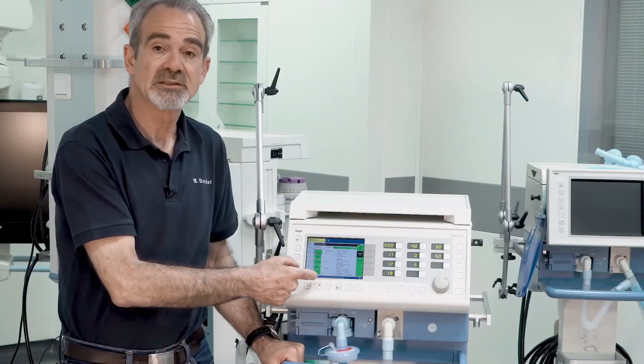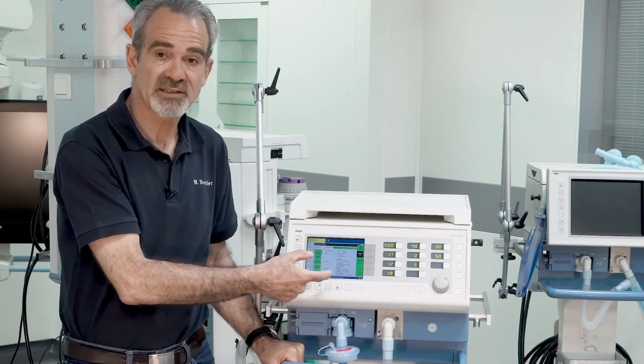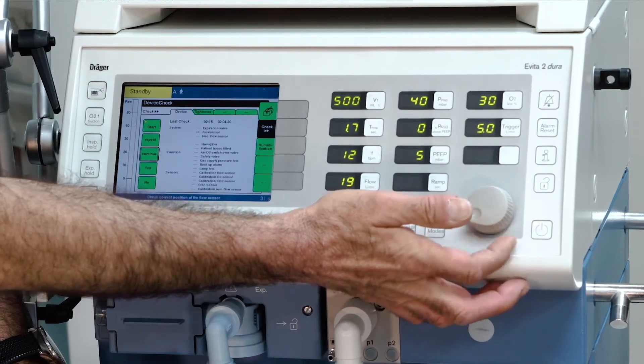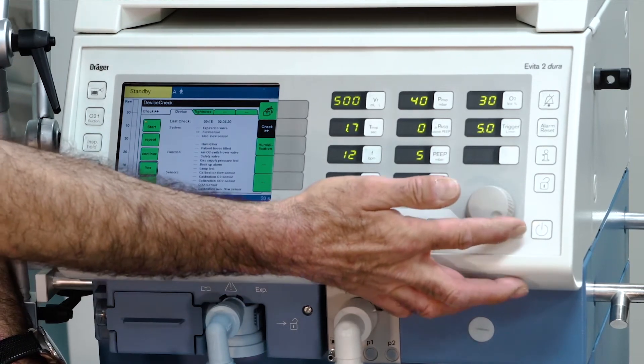Be aware that several steps are necessary. Confirmation is required with yes or no on the screen.